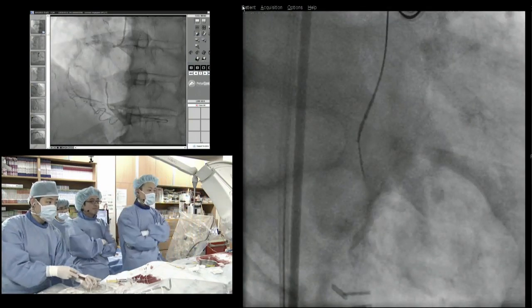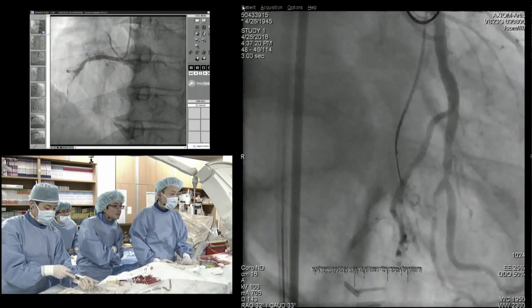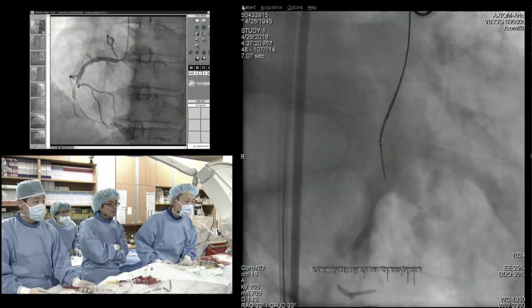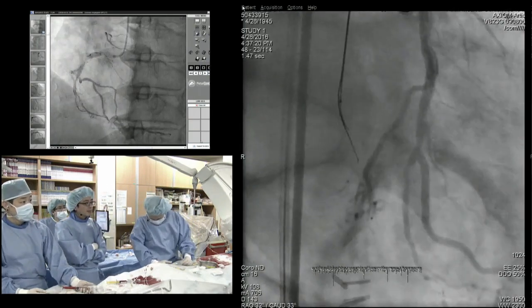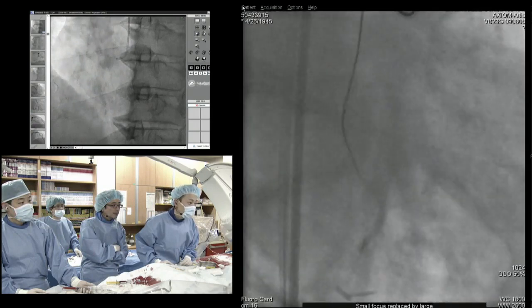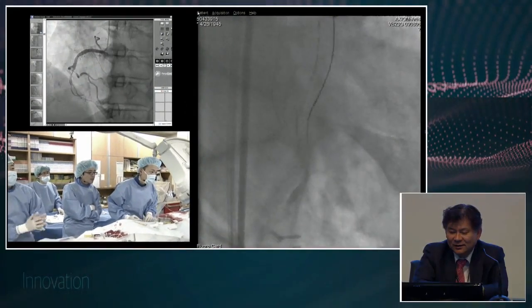Very near. Yes. Still feel resistance. Distance? Still feel resistance. Looks like some resistance.